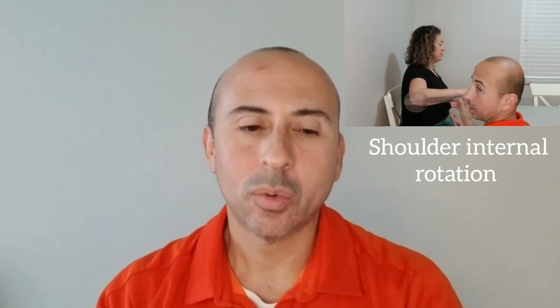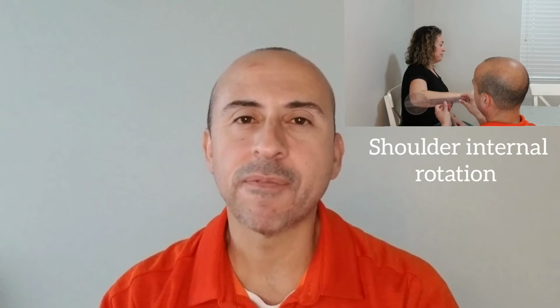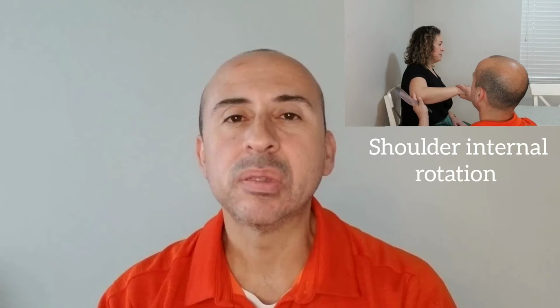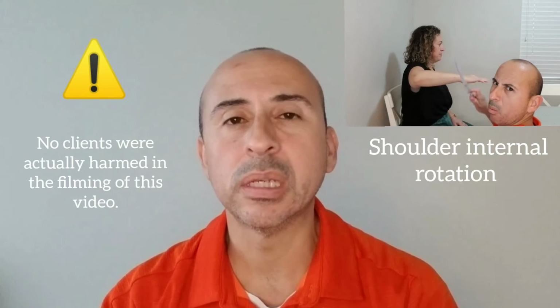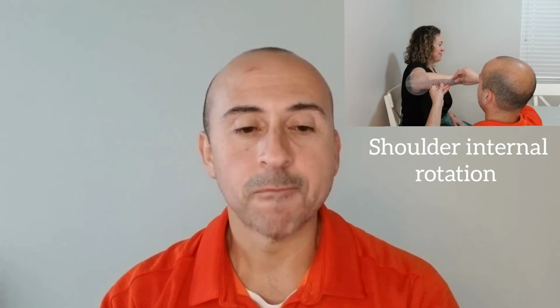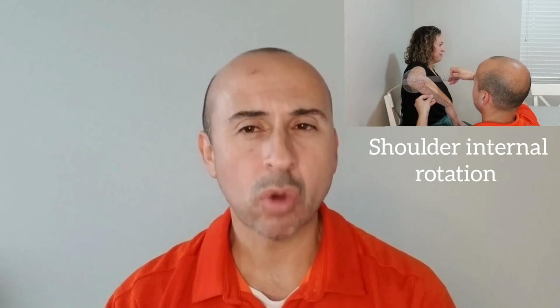For students, when I have students doing clinical rotations, some of the major challenges I find is sometimes just the placement of the goniometer is a challenge. And sometimes it's just the basics. Remember your anatomical locations and the movement that you're trying to do.